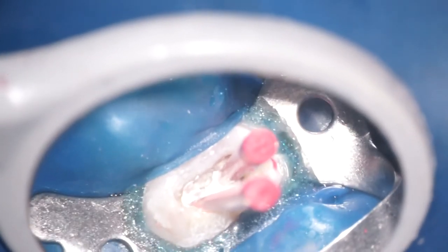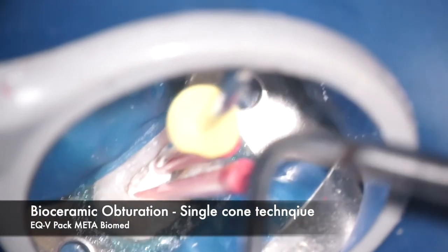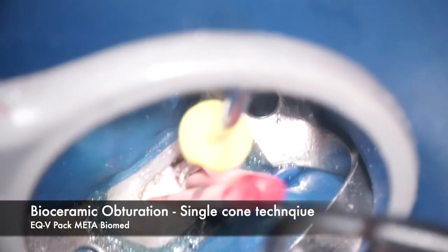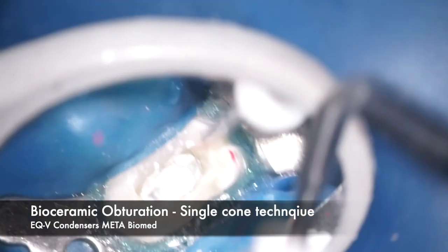The remaining part of the canal is filled primarily with the bioceramic sealer. Once the single cones are placed, we remove the excess gutta-percha above the level of the orifice with a heated device such as the EQ-V Pack from Meta Biomed. Once excess gutta-percha is removed, we use the stainless steel end — the fat end of the plugger — to pack the material at the level of the orifice.